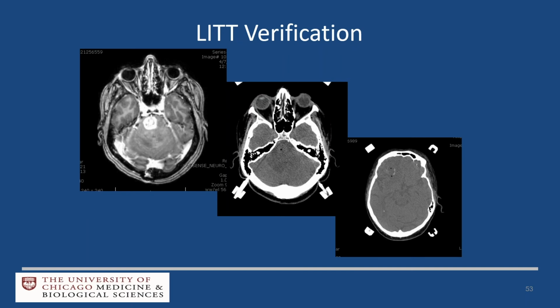We then have to take the patient to the interventional MRI scanner. So once we've done the stereotactic implantation, we always do an intraop CT before we take the patient to the MRI to ablate and make sure that our fiber is exactly in the right calculated target, which is even more important if you go down to the bottom right, where you can see 2 dots, which was a very large radionecrosis, and where we had to implant multiple fibers to cover the volume adequately.